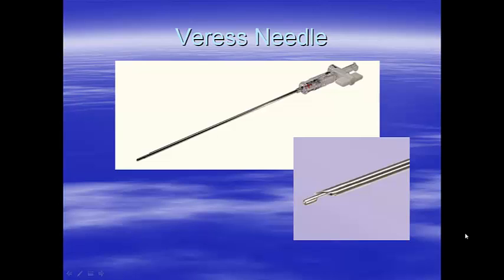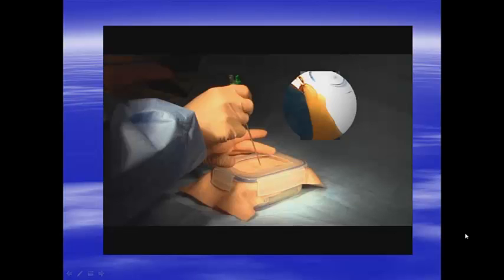A 5-10mm incision is made in the infraumbilical region through the skin and subcutaneous tissue. The Veress needle with an open tap is inserted infraumbilically at an angle appropriate to the body habitus of the patient. When the needle enters the peritoneal space, the obturator will recoil with a single or double click.